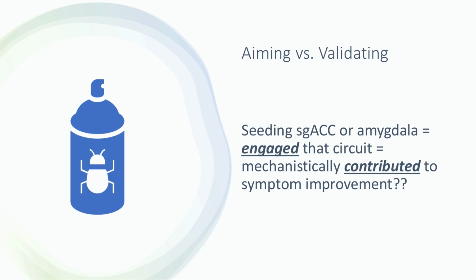That's really cool, except that we were aiming at the subgenual connectivity target, and the clinical evidence on its own is not enough to say that we actually engage that circuit, that when you fire TMS to that location in cortex, obviously we're not stimulating subgenual directly, and we were aiming to target it, just like the same protocol and many others. It doesn't mean that we actually got the target.